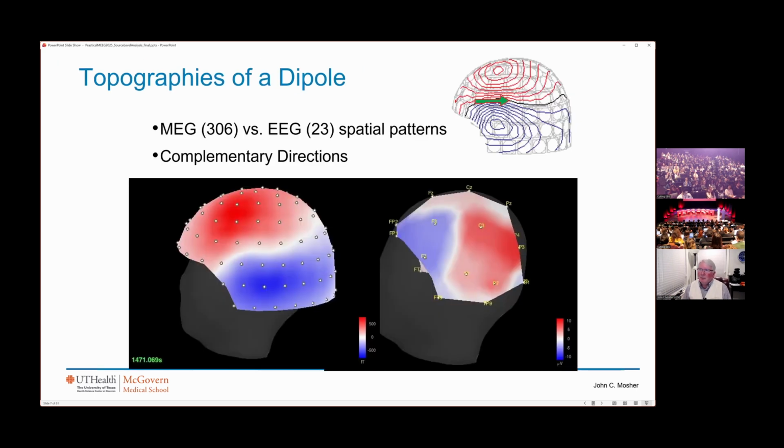It's also important to note that EEG is always very complementary, and I mean that in the very strict literal sense. It's not redundant or supplementary, it's complementary in that if I have a current dipole here and I have my red and blue, so again, the right-hand rule is showing me the correct direction. I see the zero crossing line running in the direction of the dipole. It's a black line here, but a white line here in the mapping.